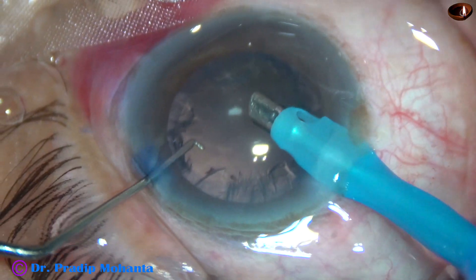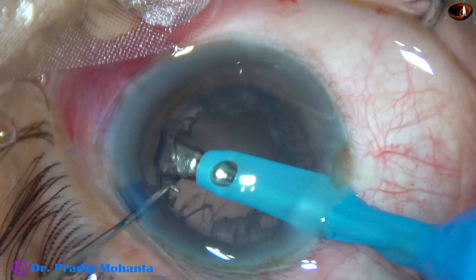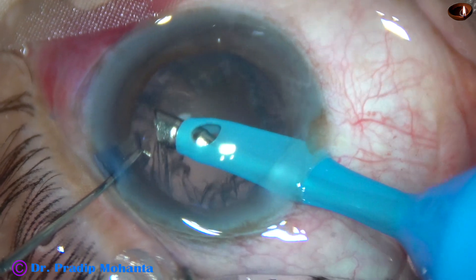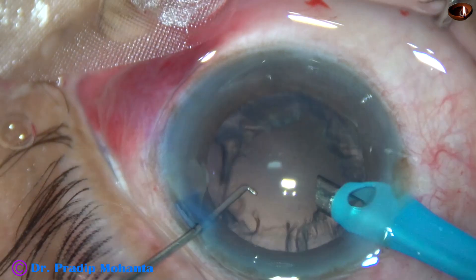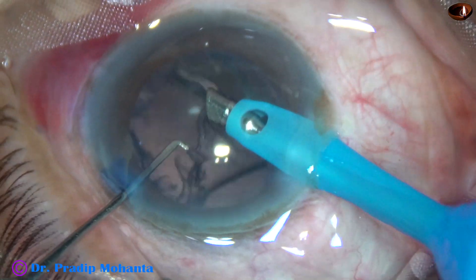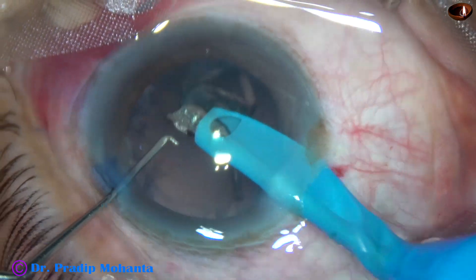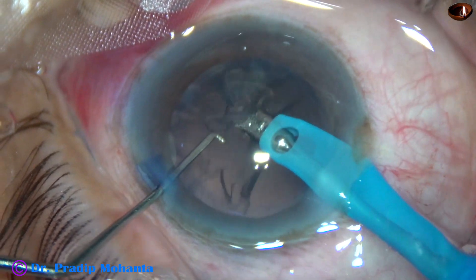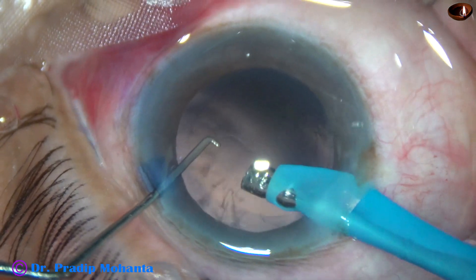Emulsification of the nuclear pieces is done and now cortical cleanup. I go to I/A mode where the vacuum is 200 and flow rate is 20. For this technique, you must watch videos of Dr. Neto Rosatili from Brazil and Dr. Sunil Thangaraj from Chennai.